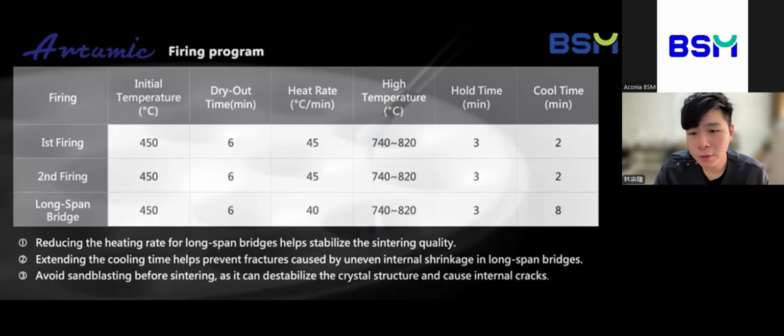One more thing to keep in mind: if you are working on a long span bridge, the cooling time should be extended to about 8 minutes to avoid rapid cooling that may cause the zirconia to fracture.